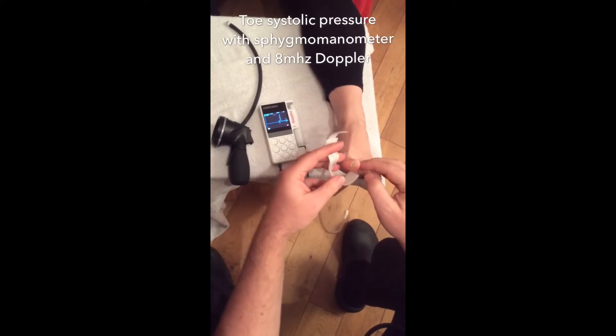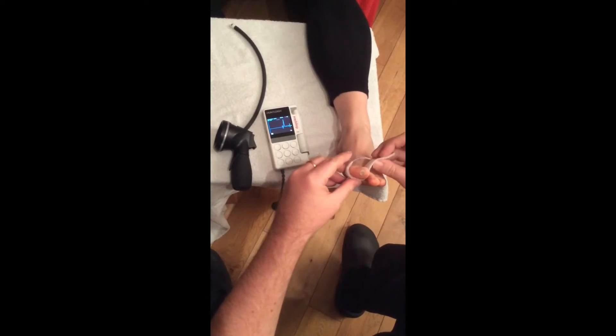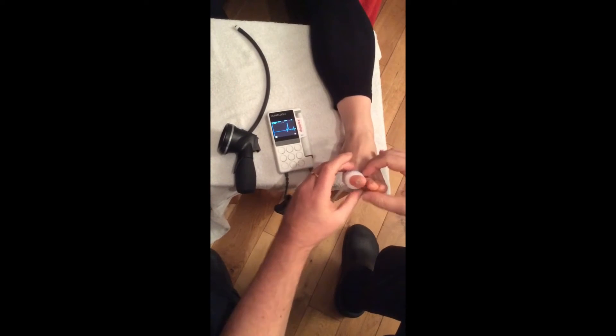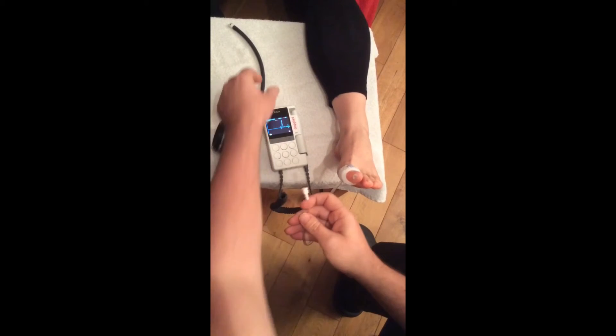Put the toe cuff around the big toe, using parallel wrapping. Attach the cuff to the body of the sphyg.